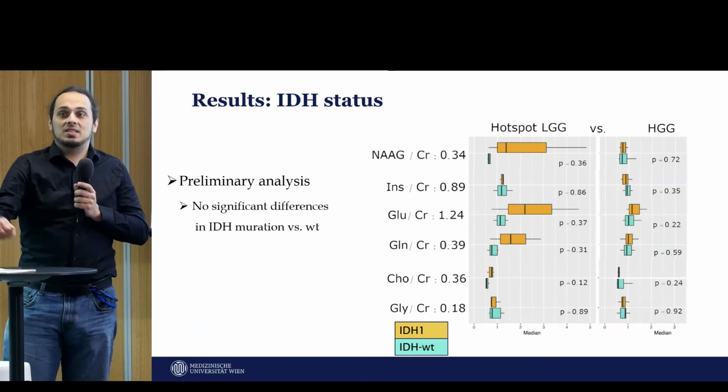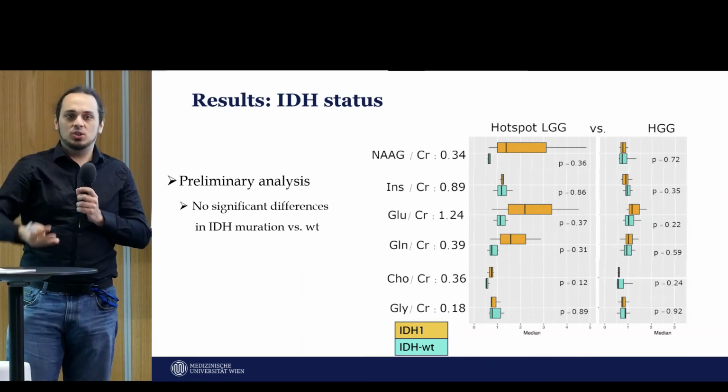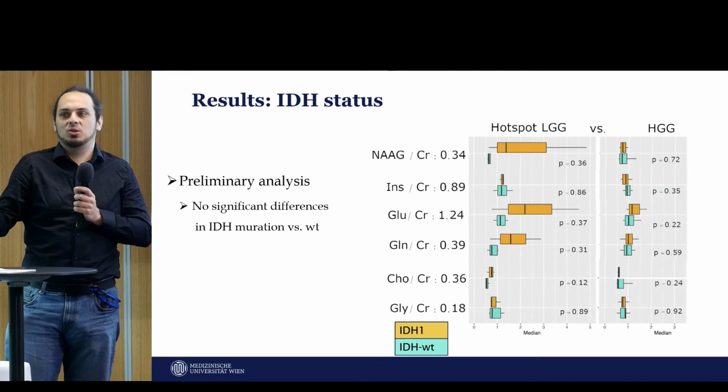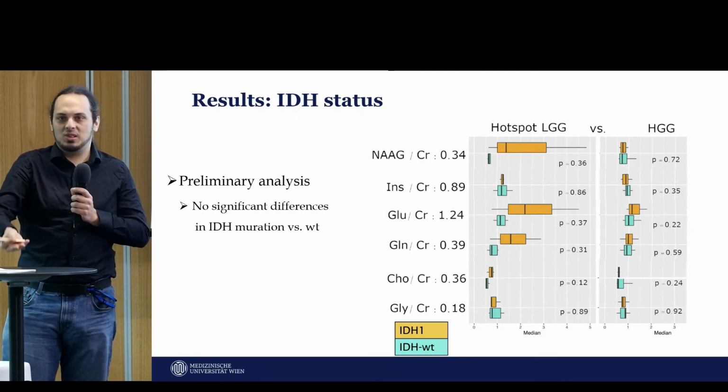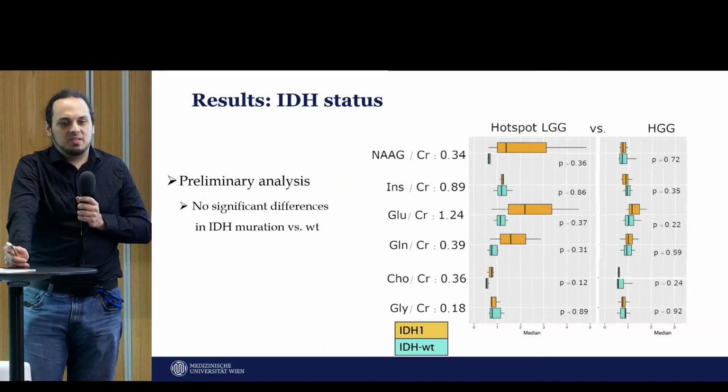So we have to use a lot of parameters that are not independent of each other, or you easily produce artifacts. Let's say your NAA decreases in the tumor, your hotspot increases by the division, but at some point you don't get an NAA fit at all. You divide by 0, you have to exclude the voxel. So maybe the most interesting voxels you cannot even include with that. As you see, this is causing some of these results here to be not that interesting.